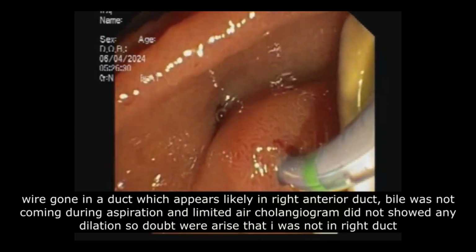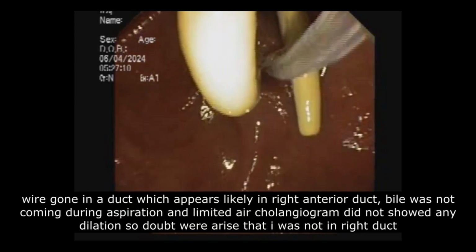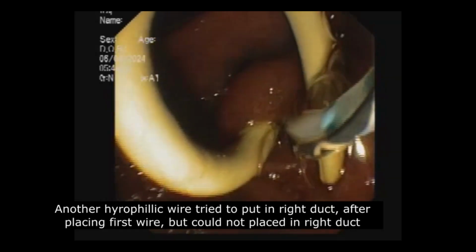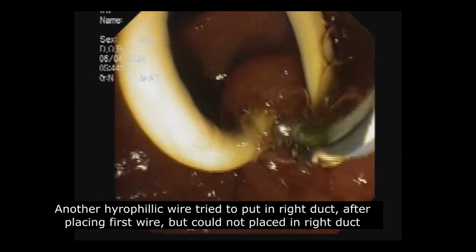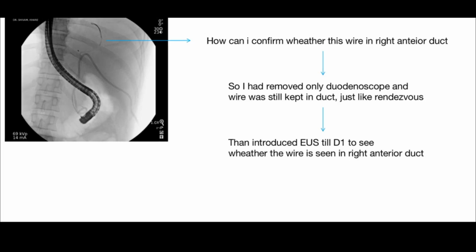During ERCP, the wire went into a duct which appeared likely to be the right anterior duct, but bile was not coming during aspiration, and the limited cholangiogram did not show any dilatation, so doubt arose that I was not in the right duct. Another hydrophilic wire was tried to be placed in the right duct after placing the first wire, but I could not place it in the right duct. So how can I confirm whether this wire is in the right anterior duct?